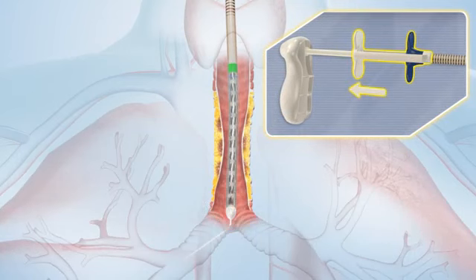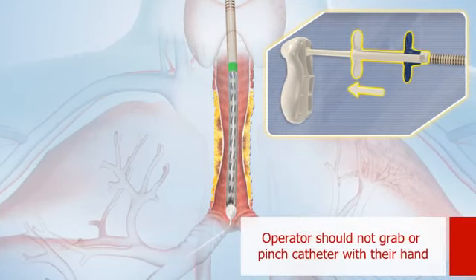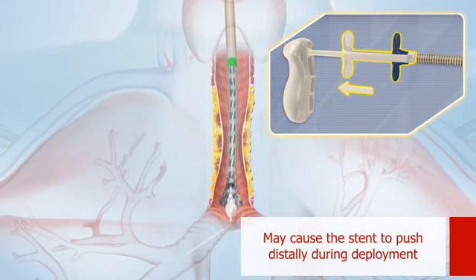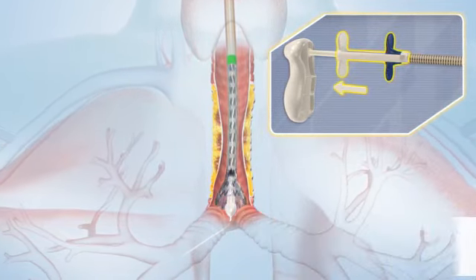The outer sheath is slowly retracted to begin deployment. The operator should not grab or pinch the catheter with their hand as this may cause the stent to push distally during deployment.